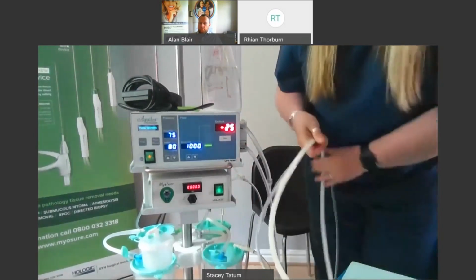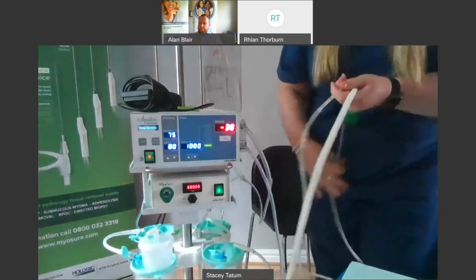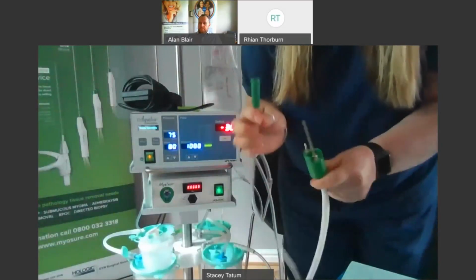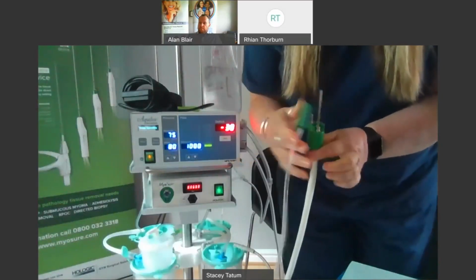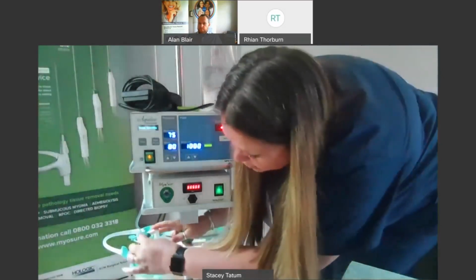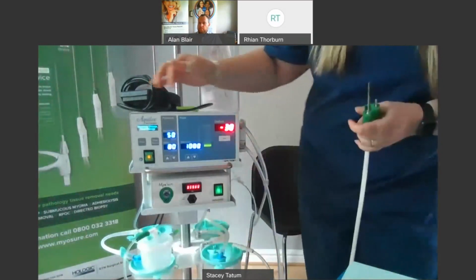And two ends will be passed off to whoever's circulating. They are both green. So it's always best to put this suction tubing on first, and that goes onto your tissue trap. It needs to be nice and tight.